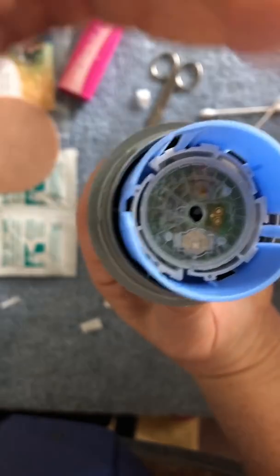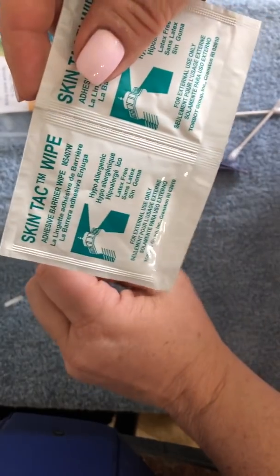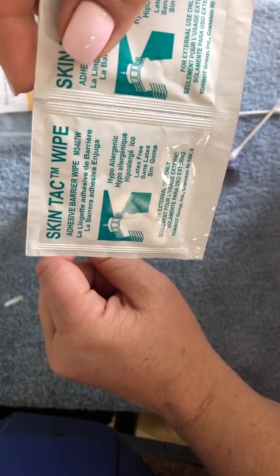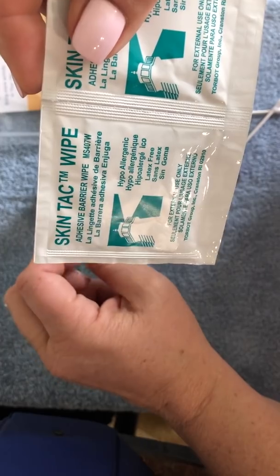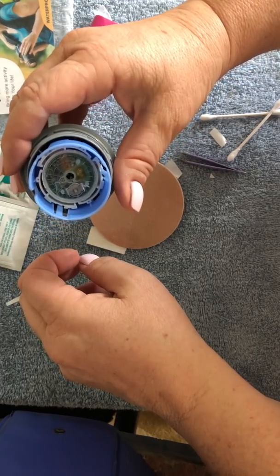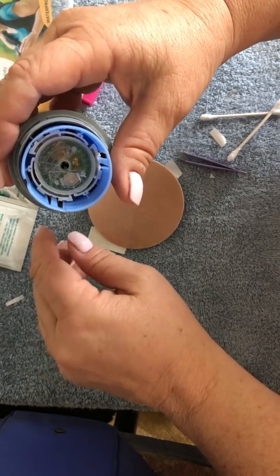And then what I do is I use skin tack on where I'm going to place the sensor. Open it up. I like to use a plastic glove with this, because if you don't, your fingers get really sticky. So I use a plastic glove. I put it where it should be, wait a couple of minutes. Then what I do is I push the sensor into my arm and make sure that it's really in there, kind of push down on it lightly.